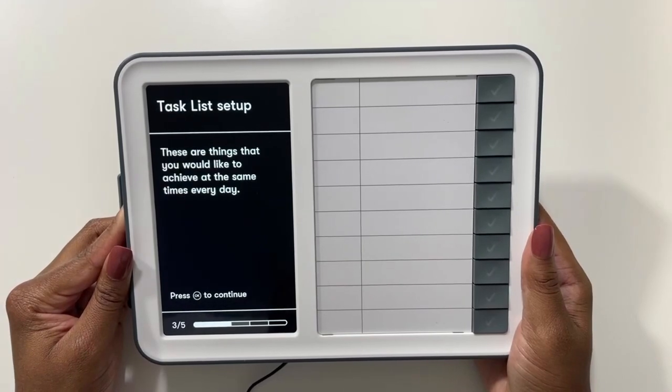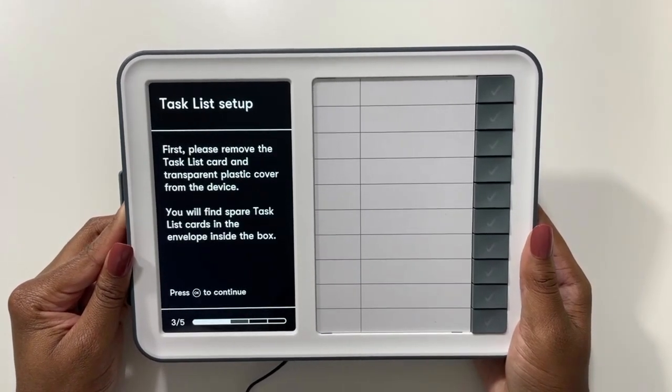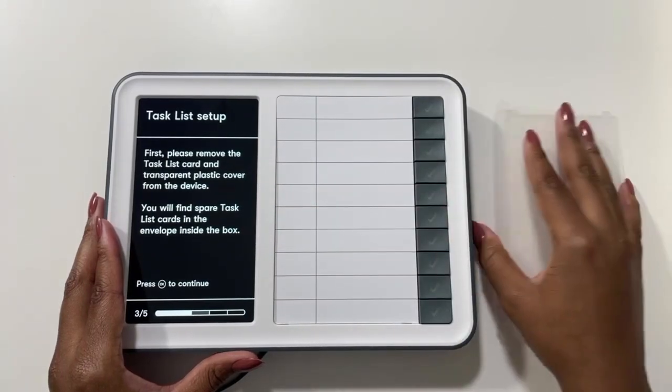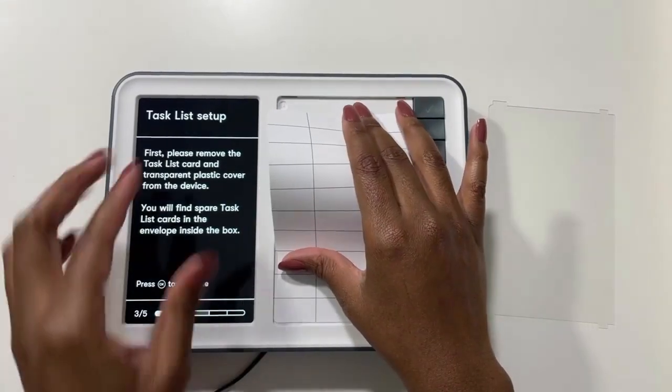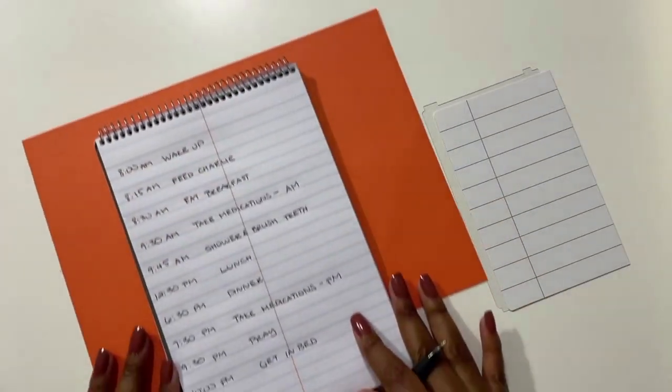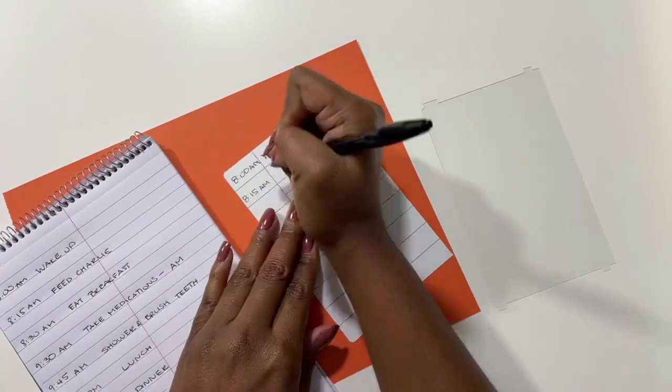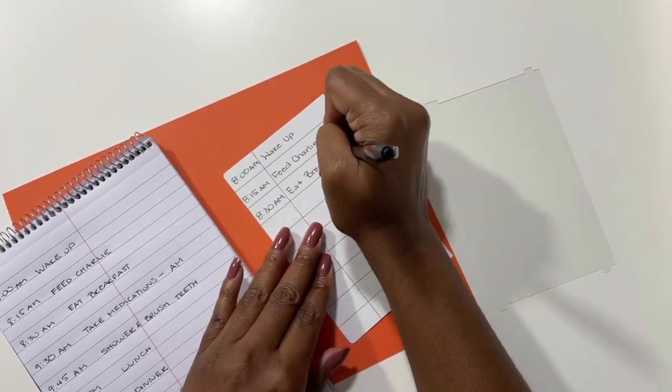Now it's time to set up our task list. First we have to remove the plastic cover and the task list from the device. Then what I did is write my tasks down on a scratch piece of paper before writing them on my task list.